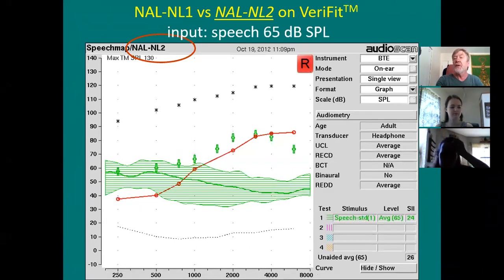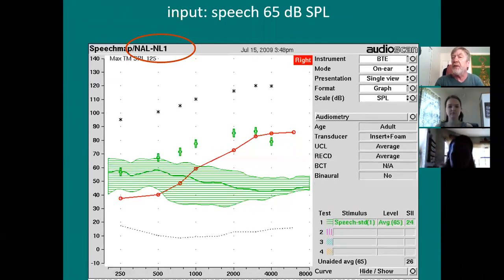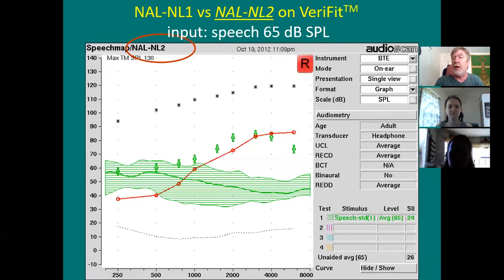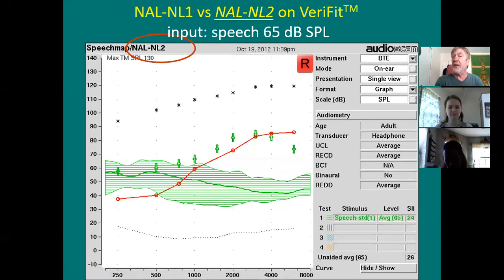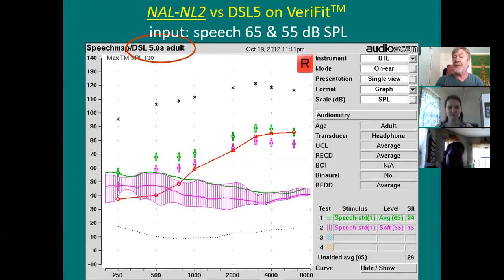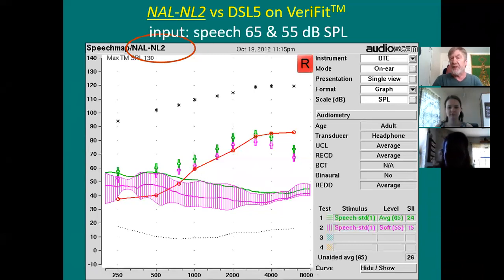If I go to NAL-2 versus NAL-1: NAL-2 — notice the target extends all the way out to 6,000 Hz, whereas NAL-1 doesn't. That's one thing that distinguishes NAL-2 from NAL-1. Second, NAL-2 drops its requirements in the mids compared to NAL-1. So NAL-2 is more like DSL-5. If you're comparing DSL-5 and NAL-2, you've got two different targets. The purple or pink is the soft input targets, and the green is the outputs you'd want for average inputs. You're getting two different inputs: 65 and 55 on the bottom right — soft being 55, average being 65.